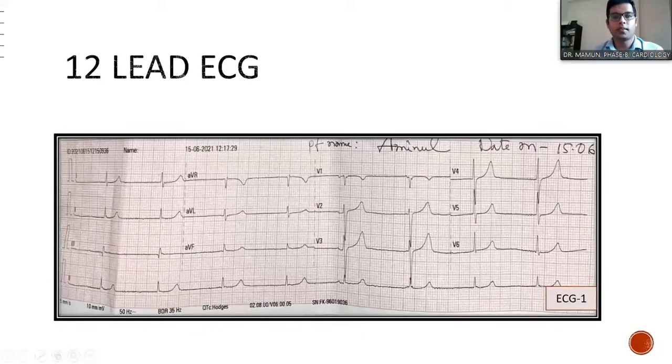This is the 12-lead ECG done in the emergency room, showing rate about 50 beats per minute, and there is loss of P wave. The most prominent finding is tall T that is pointed and peaked with narrow base. My colleague did not agree with me about the hyperkalemic T.